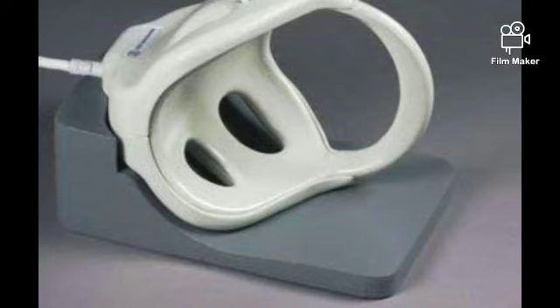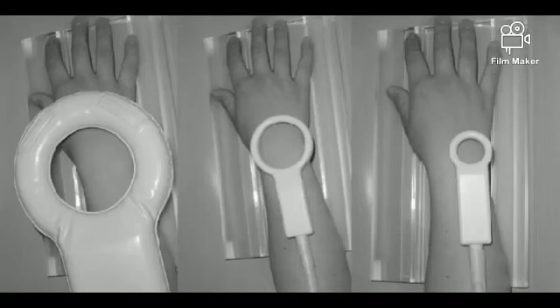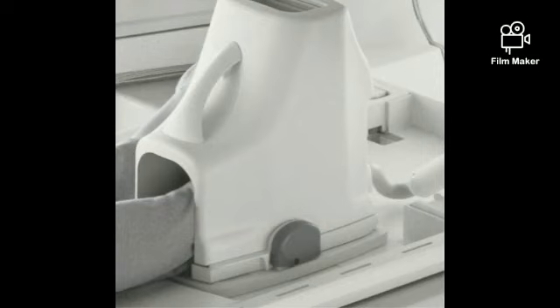These are the shoulder coils, used for the study of the shoulder, and they are a type of phased array coil. These are the MRI knee coils, a type of volume coil, mainly used for MRI knee studies. These are the MRI wrist coils, and they are a type of phased array as well as volume coil, but to get better image quality we prefer the phased array one, and this is the volume type one. These are the foot coils. This is used for MRI foot, and it's a type of volume coil.